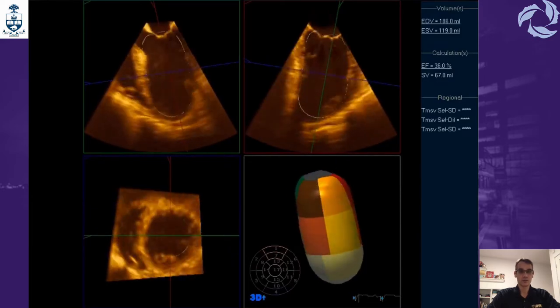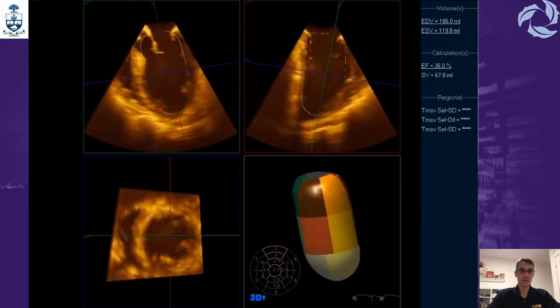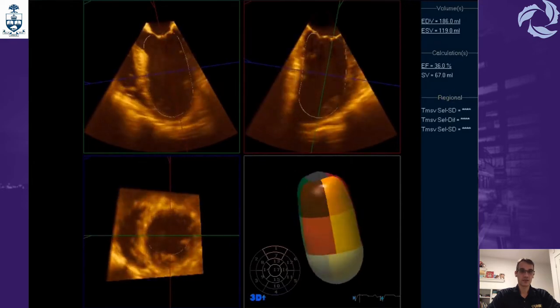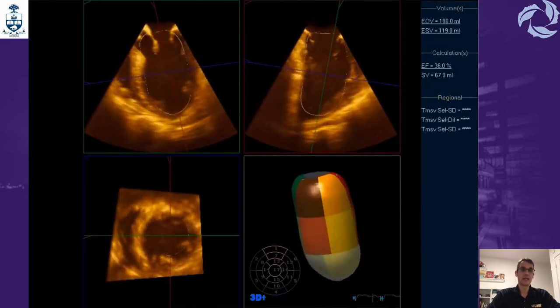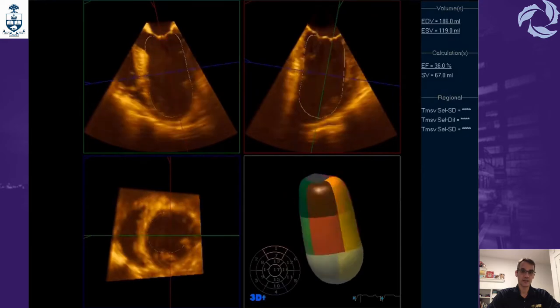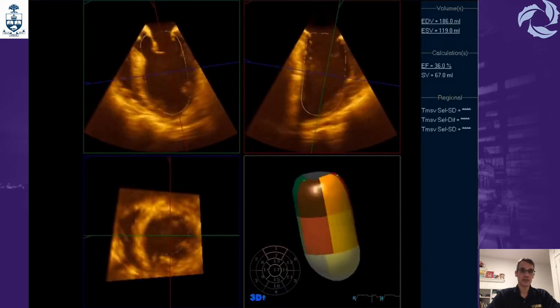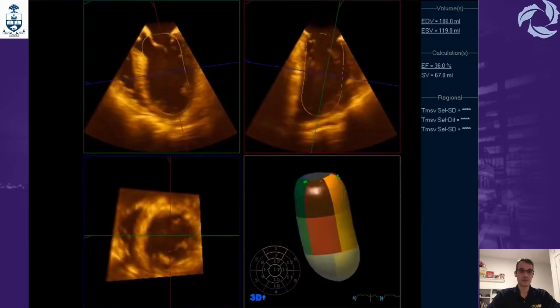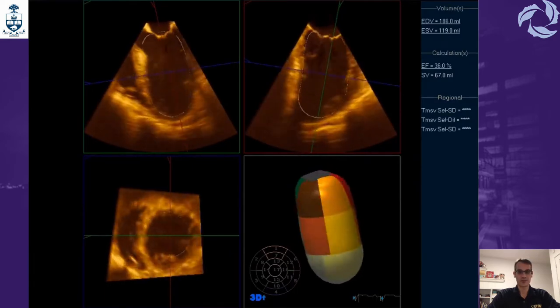In the bottom-right of the screen, the 3D display of the LV can be manipulated — you can view it from the base, from the apex, or from the inferior part. You can touch any of the 17 segments on the display, which will automatically show the name of the segment and indicate how that segment is performing.